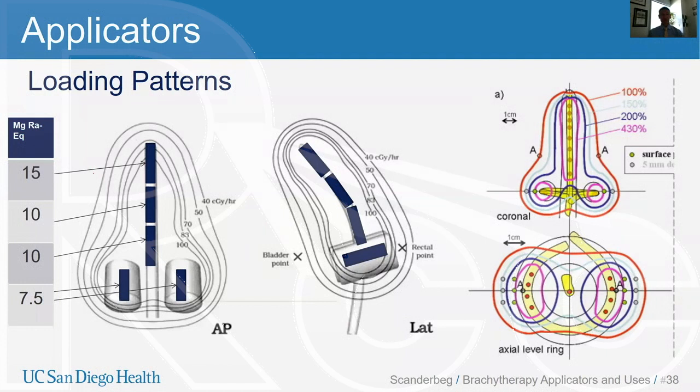In the scheme, all applicators will use a 3 millimeter step size for Varian GammaMed afterloaders and a 2.5 millimeter step size for Nucletron afterloaders. When loading the tandem, we just want to load dwell positions to the outer surface of the ovoids or the ring, not beyond them, such that the sources are protruding into the ovoids or ring or even further into the vagina. We don't want to do that.